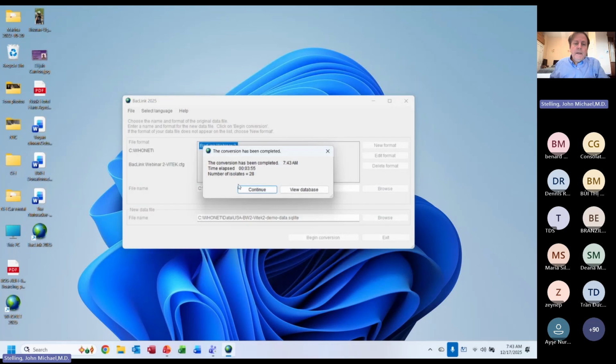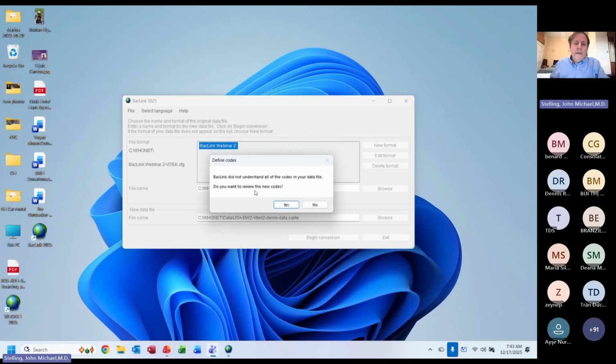And because I was talking so much, that took around 4 minutes. There were 28 records in that Vitek file. I would like to continue. We'll do a view database later. Continue. And BacLink says it didn't understand everything, and I'll come to that.